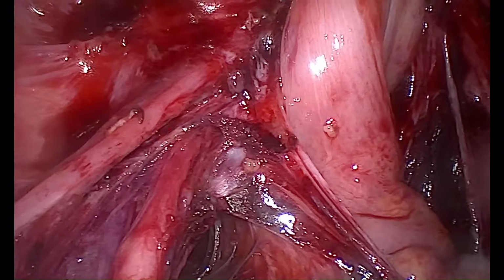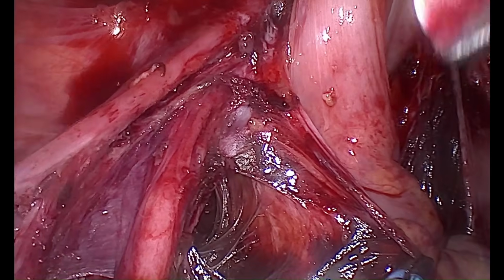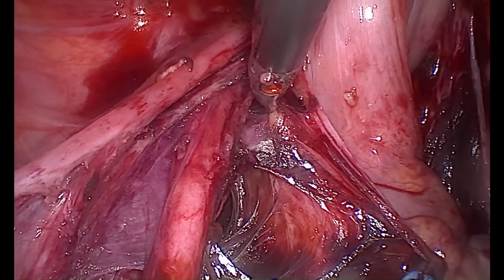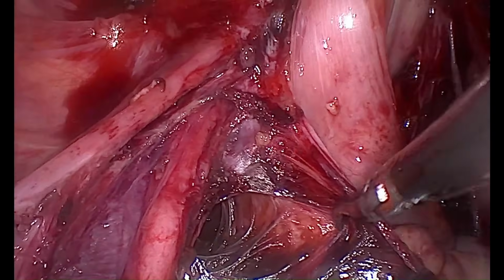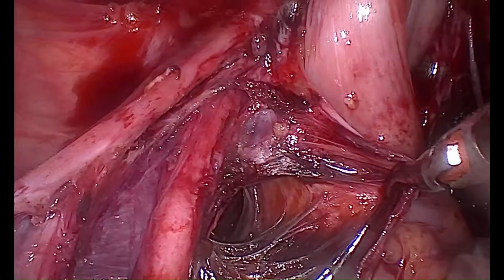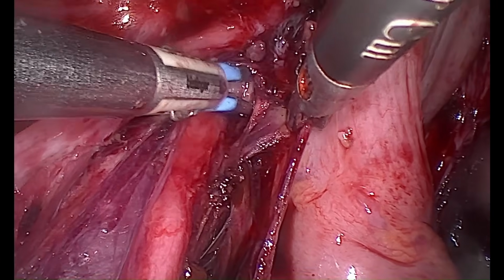You can see the bowel is adherent at the back of the uterus. The rectum is totally adherent. We are not going to see any of the spaces out here. So it is prudent that when you are doing this kind of dissection in this particular plane, it is going to get more and more difficult.